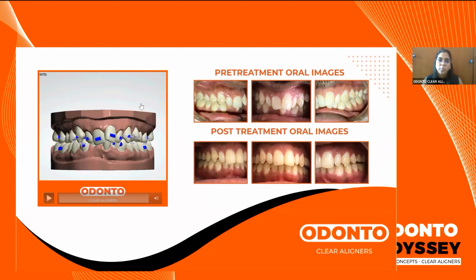After last aligner, for permanent retention, will we give additional aligner as retainer within the package? Yes, we do give the retainer, which is part of the package. Once the treatment is complete, you have to evaluate the case as to whether you want to go in for the retainer or whether you require any refinement. Now, a refinement is where if there is any mild rotation which has not tracked optimally, you want further correction for it, then do not request for the retainer, request for a refinement, wherein you will have to send a new scan, and we will make that fine correction for you, and then you can progress and go ahead with the retainer, which will be a clear retainer.